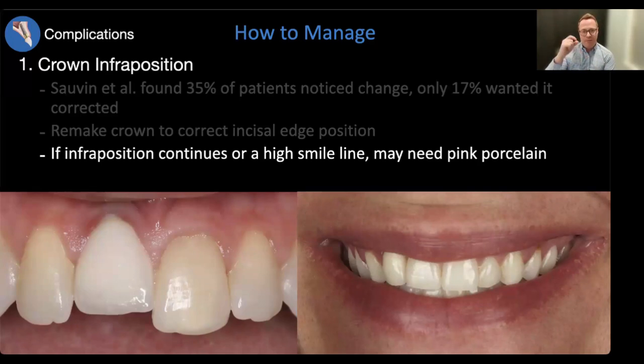So while I have a lot of incisal cervical room, or restorative space, the implant position means I can't bring the neck or the facial surface of this tooth more lingual to help make it look smaller, just because of the position of it. So for this patient, it was determined that I really couldn't make that much improvement, so we actually left it for now.